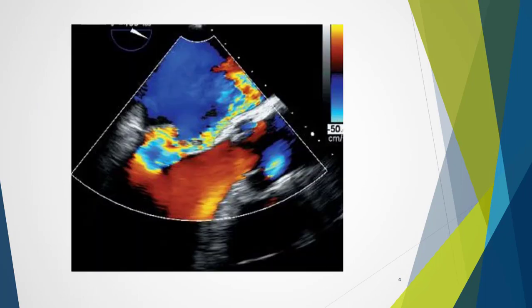And here we have an example of mitral valve failure with the eccentric mitral regurgitant jet. The jet hits the wall and smashes it and then runs along, and it splays out like if you were to get a hose and then point it at the ground, the water would splay out. And so in doing so, it looks much less impressive than if you got the hose and you squirted your friend 5 meters away.